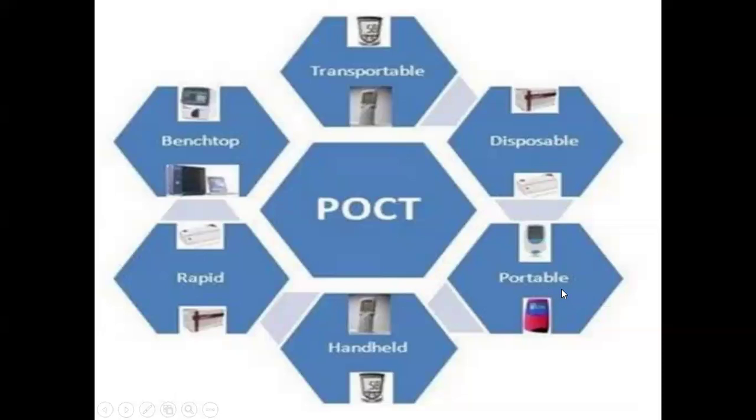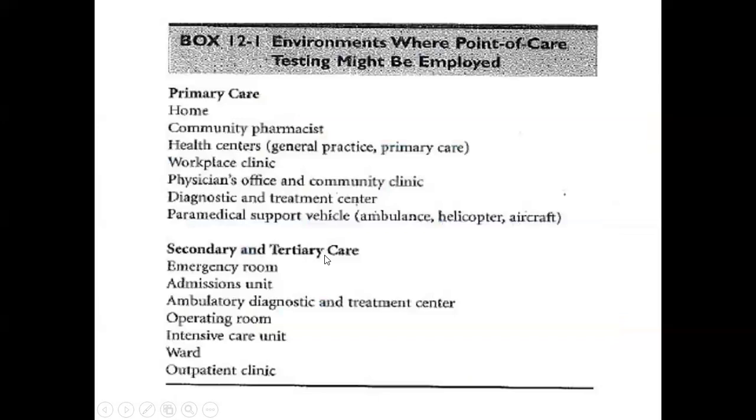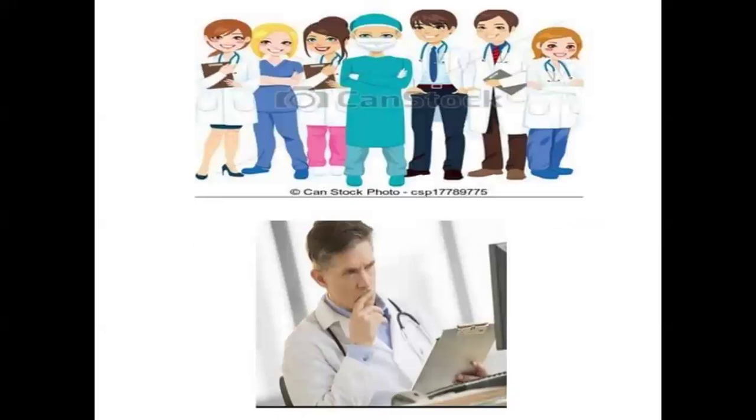These testing devices are handheld, they are very rapid, and some may be benchtop. All this can be done with POCT. There are some environments where you can do point of care testing: the home, community pharmacies, health centers. Anywhere you can use point of care devices.